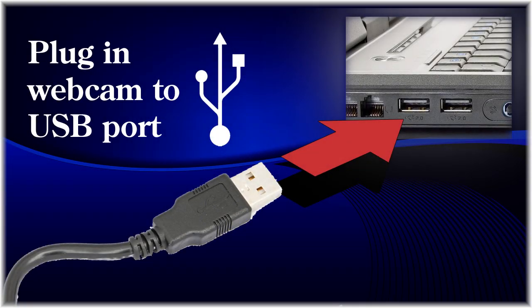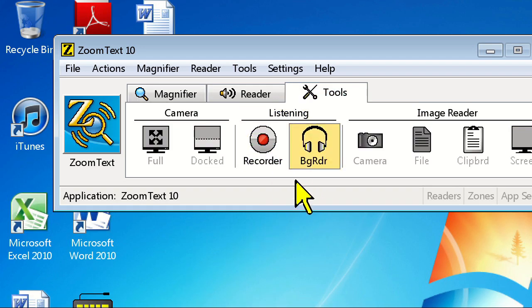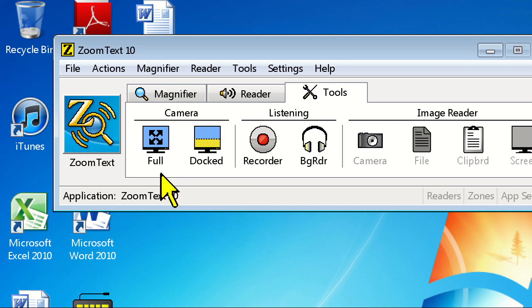First, make sure that you've connected your camera to an open USB port on your computer. Once the camera has been detected, you'll see the buttons on the ZoomText user interface light up, informing you that it's been connected.